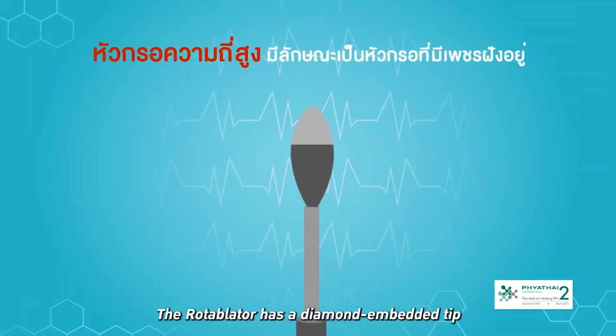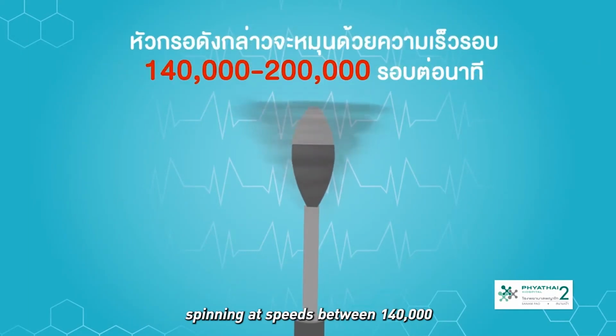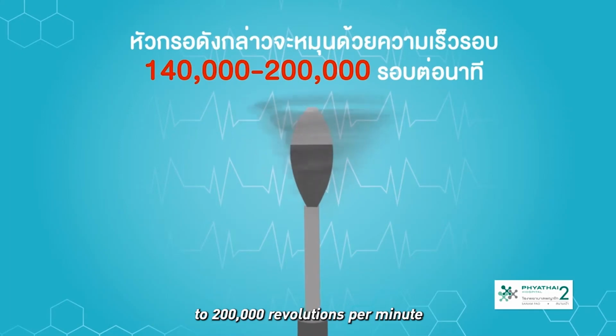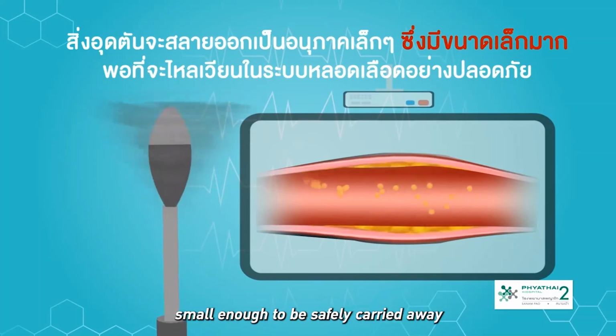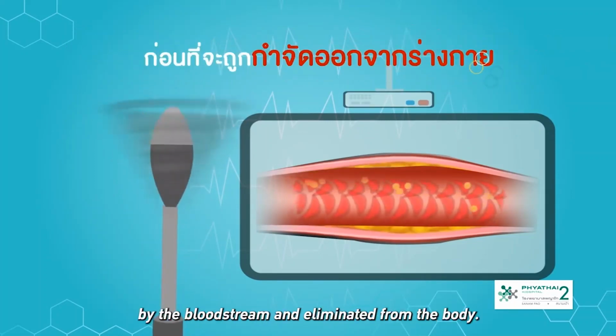The rotoblator has a diamond-embedded tip spinning at speeds between 140,000 to 200,000 revolutions per minute, breaking up blockages into tiny particles small enough to be safely carried away by the bloodstream and eliminated from the body.